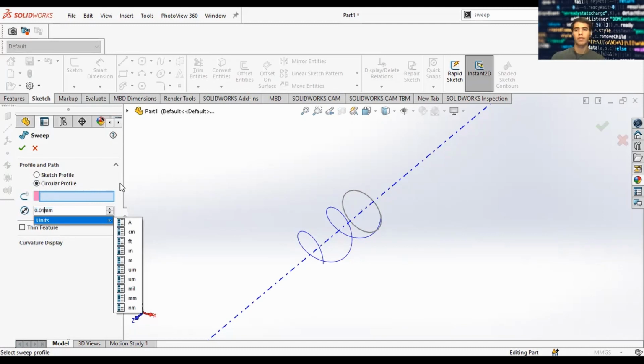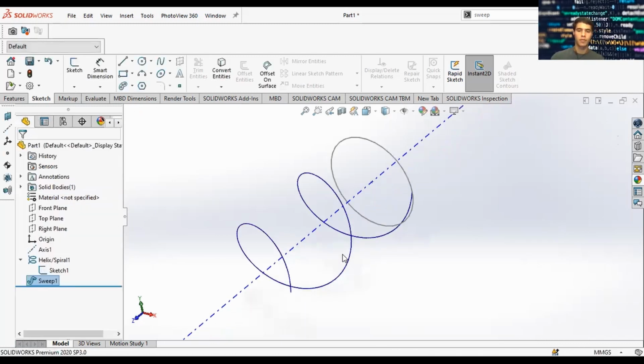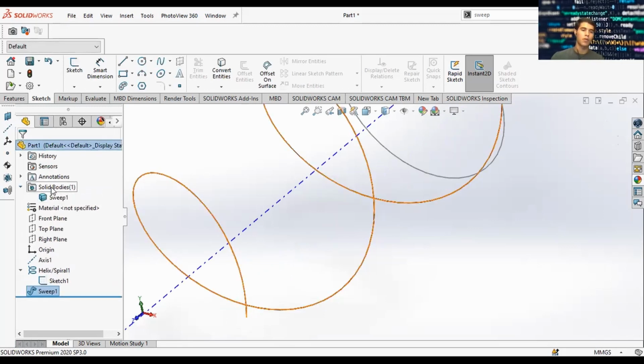This is the thickness of the profile. So our wire strands will be 0.01 millimeter thick. And we selected our helical spiral. And there's our solid body. So now we have on our family tree one solid body, and that's the sweep that we just did.